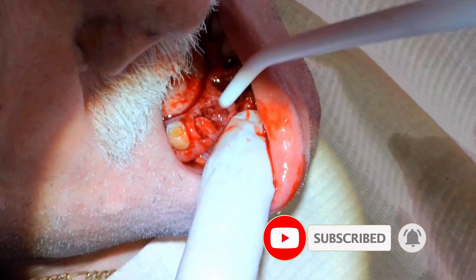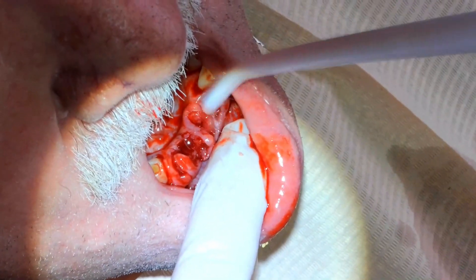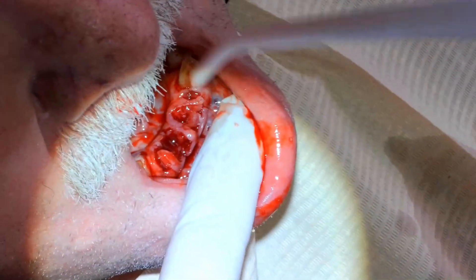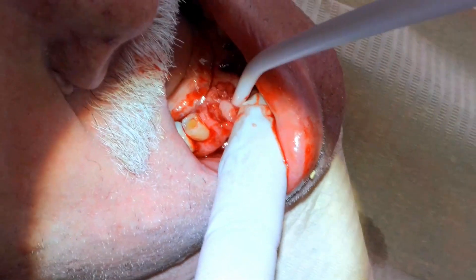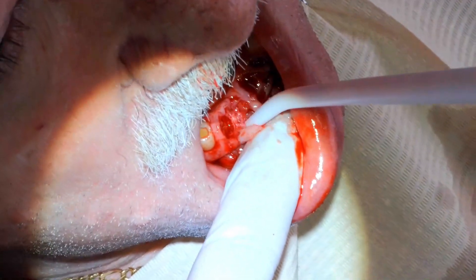Let me take my surgical suction and check out and clean up the gums — and they look a mess. It looks like hamburger meat, pretty gross. But I decided not to cut off any extra tissue.